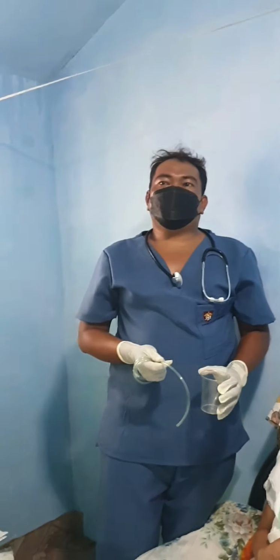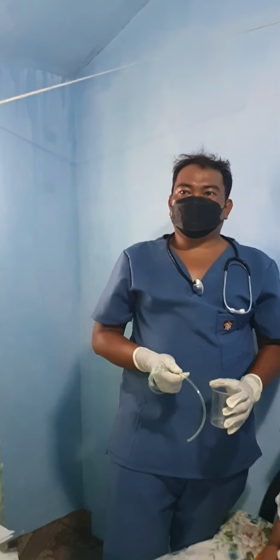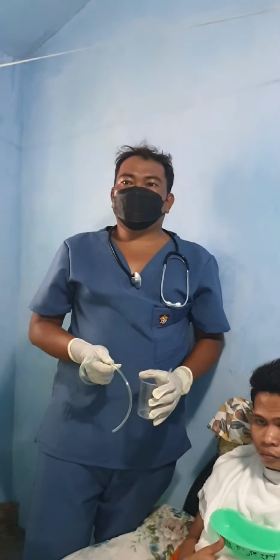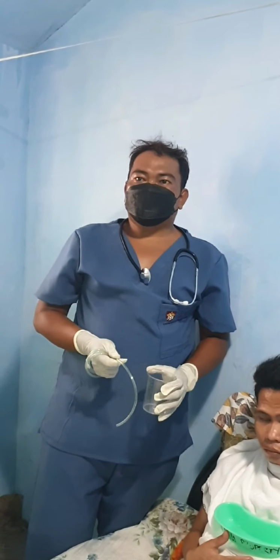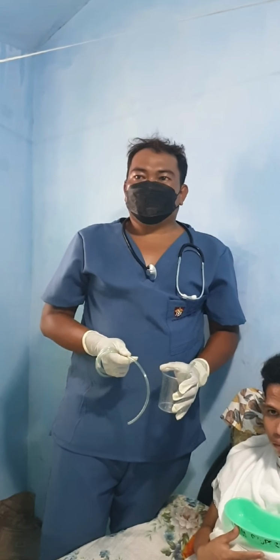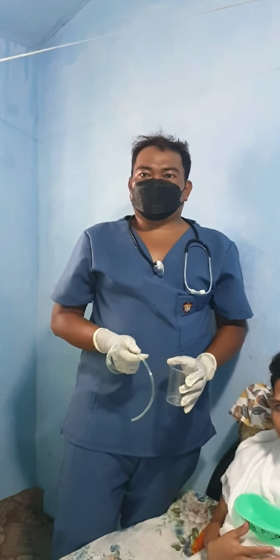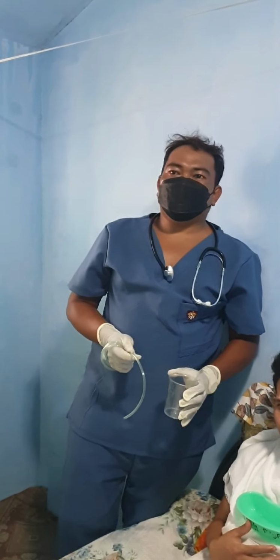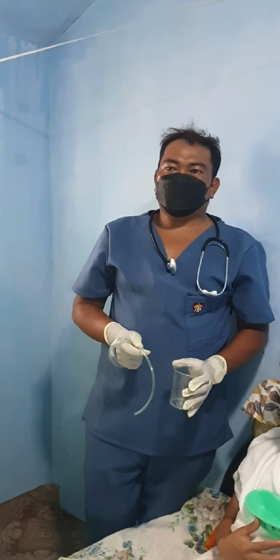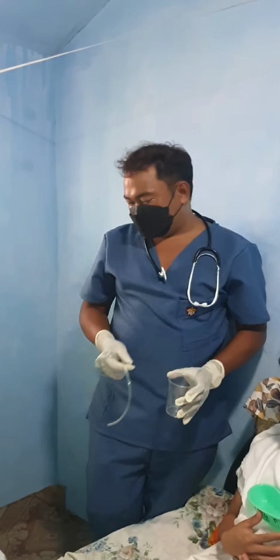If the patient continues to gag or cough, check that the tube is not curled in the back of the mouth. Use a tongue blade and a flashlight to check the back of the mouth, then pull the tube back until only the tip of the tube is seen in the back of the mouth. Then try advancing the tube again while the patient tries to swallow.